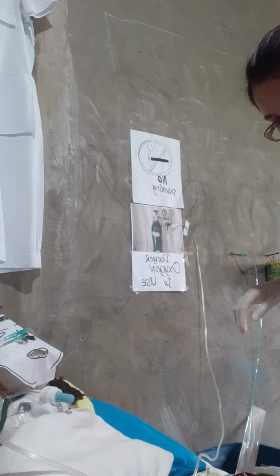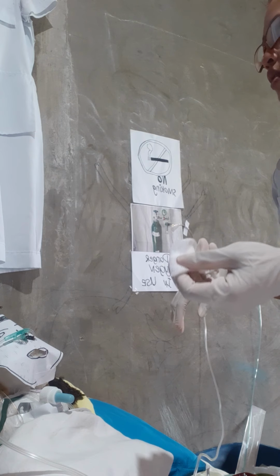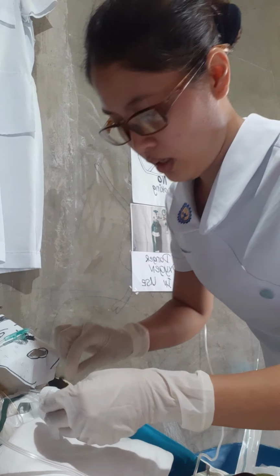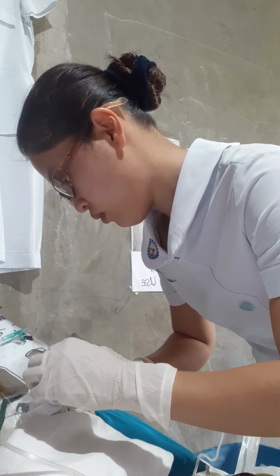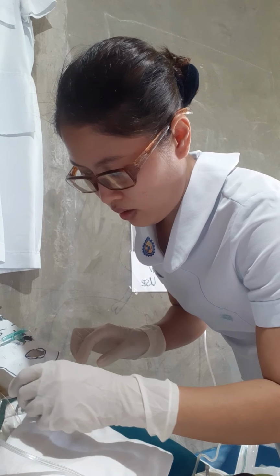Afterwards, we need a sponge or sterile gauze pad to dry around the stoma, and we just gently pat to make it dry.